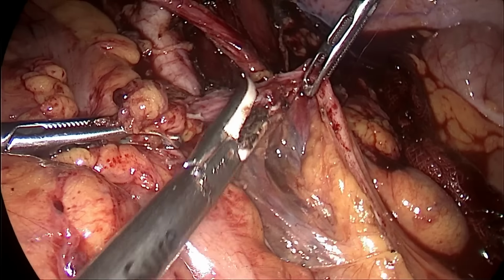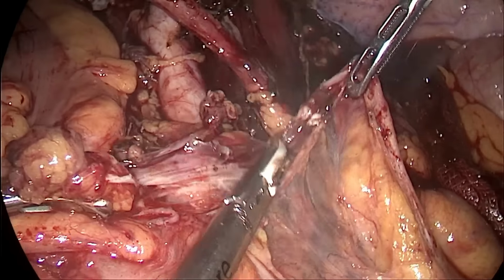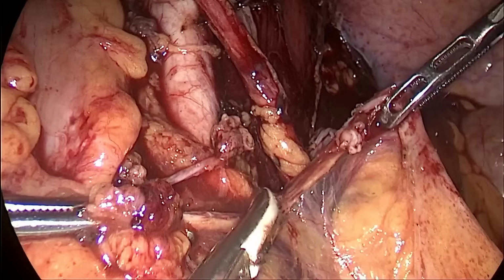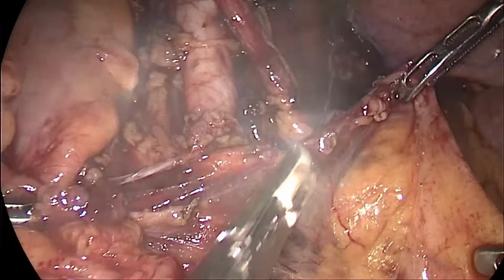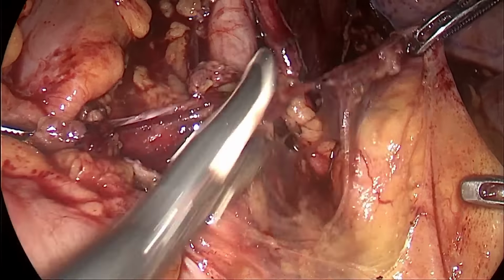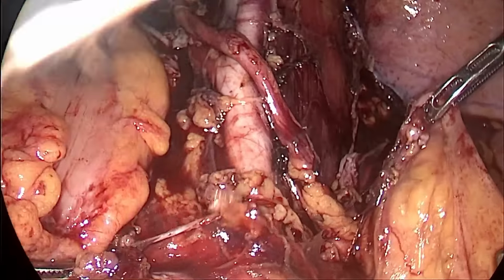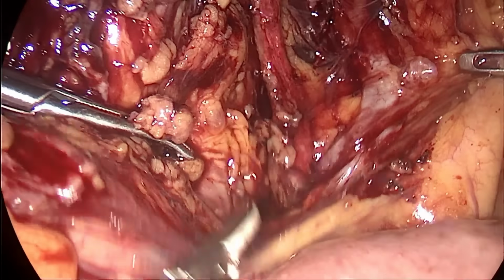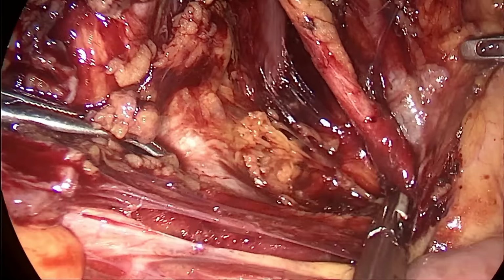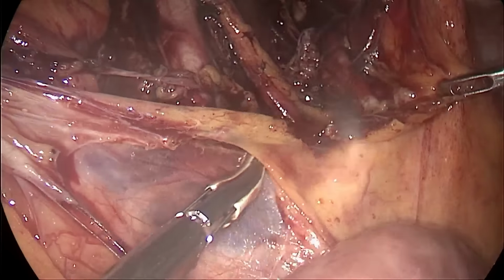Usually up to the level of the IMA, if we can dissect, we are dissecting with this kind of approach, and after that we will be making a suprapubic camera port, and all the laparoscopic instruments will be moved forward and then in the other direction. So that's our vein.